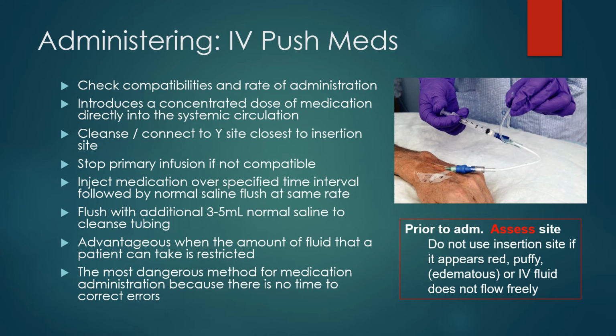Understand that. We're going to give our medication at a specified time, and we're going to flush the line at the same rate that we administer the medication to clear the line. Again, we're going to ask our patient about any discomfort as we're pushing our med. We're going to check the site for redness or swelling, and make sure that our patient is doing okay after the medication administration. Once it's done, we can hook back our primary infusion and get that going again.